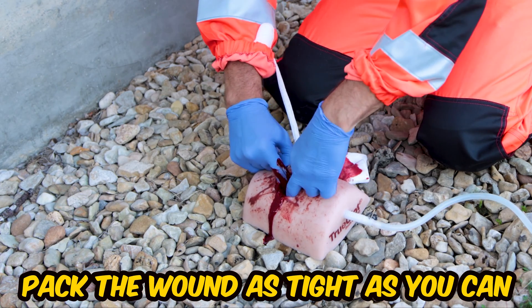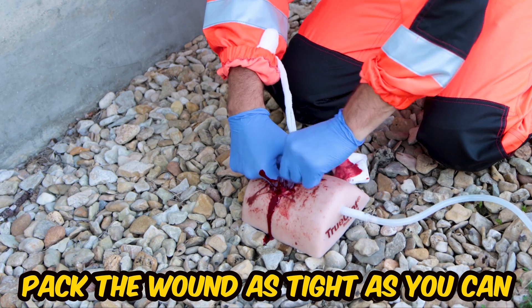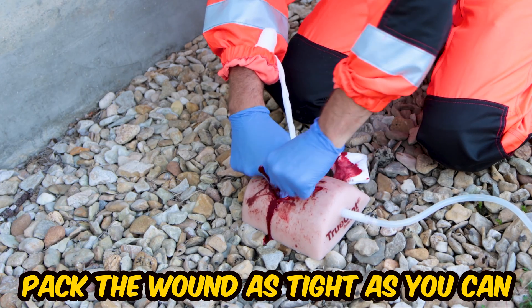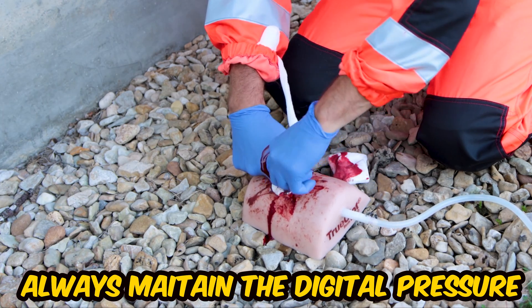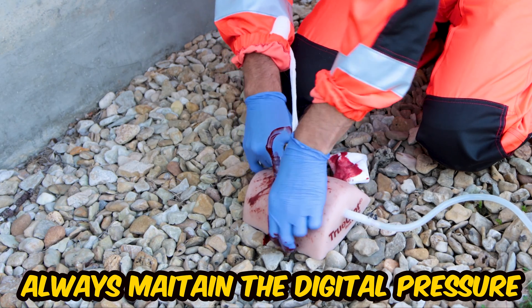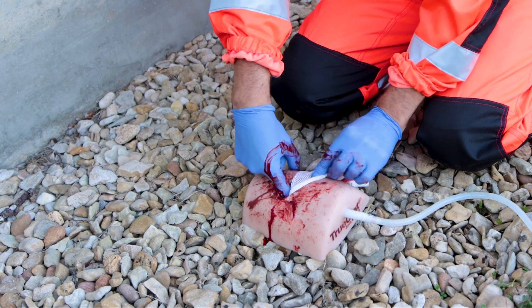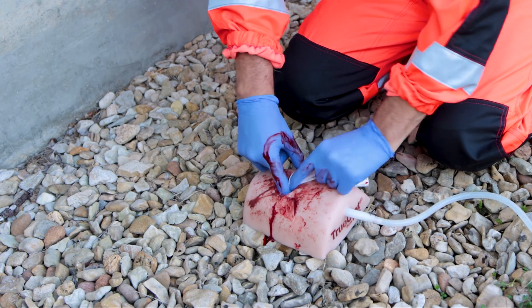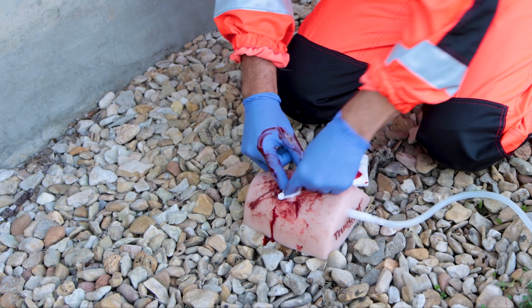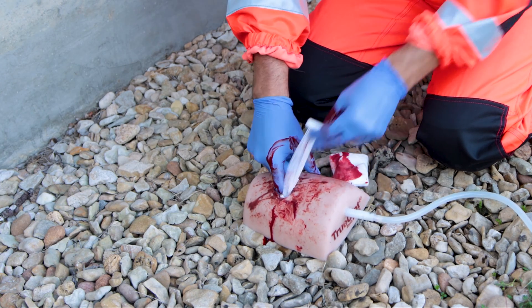Now it's time to tightly pack the gauze into the wound directly over the most active point of bleeding. There are many techniques you can use to pack the wound, but the most important thing is to never ever remove the digital pressure you are maintaining with your finger, because blood will flow again. With one finger constantly on the injured vessel, insert the gauze into the wound. See how much easier it is if the gauze is already prepared? Also note that the knot you made on the end of the gauze helps maintain digital pressure.